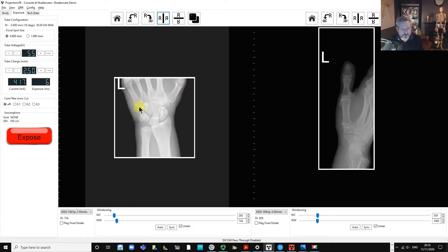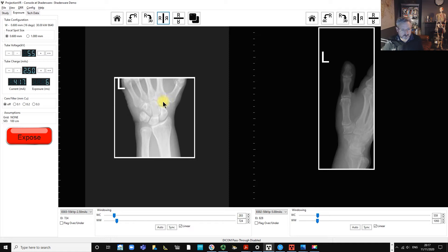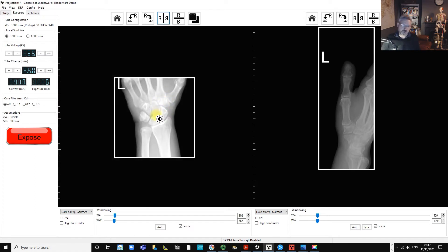We've got our PA scaphoid projection. We can see the first through fifth metacarpals, radius, and ulna, and we've got the scaphoid, lunate, triquetral, pisiform, hamate, capitate, trapezium, and trapezoid. Those are all nicely visible there.